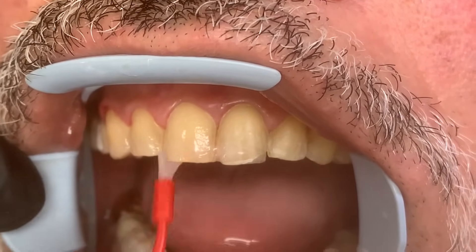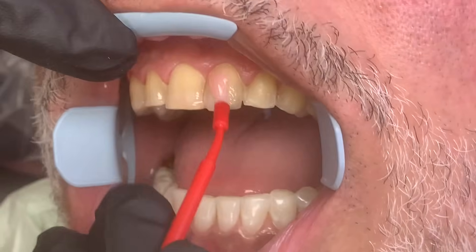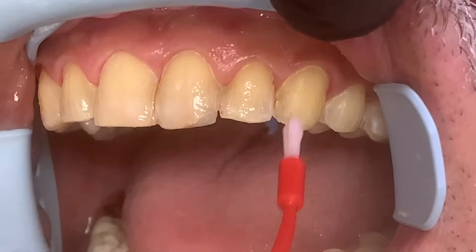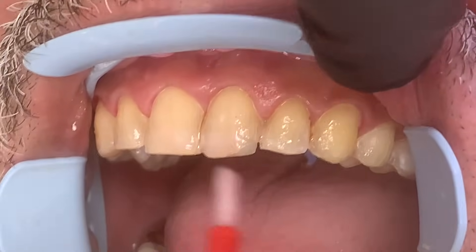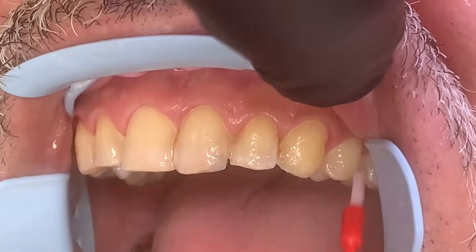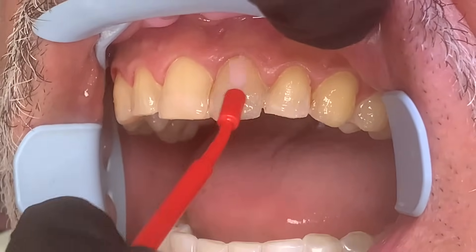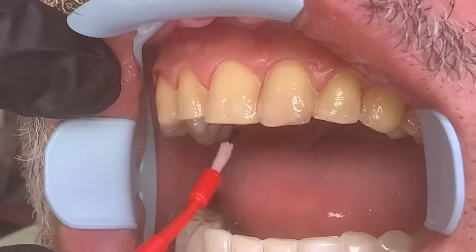These veneers are bonded on, and once they're on, they're incredibly strong. So if you ever want them off, basically you just have to drill them off. That's the beauty of veneers. Veneers do not change color — once the veneer is placed, it will not change color. Your natural teeth generally discolor as we age, but veneers do not.